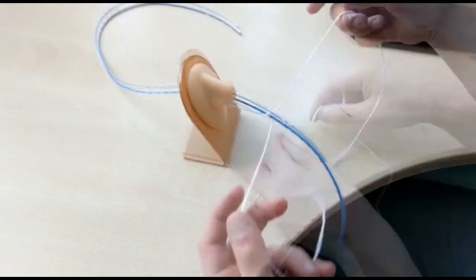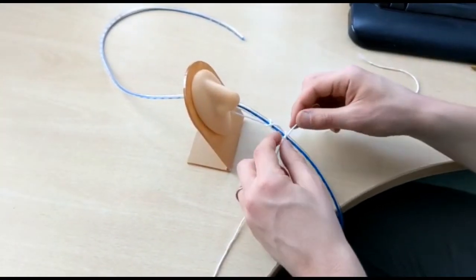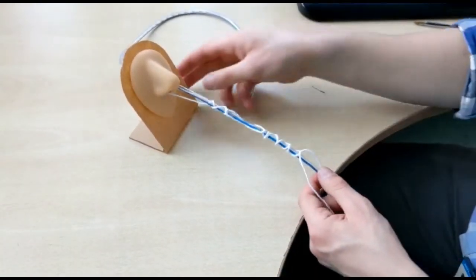Following the first knot, the string can be tied around the tube in a criss-crossing Roman sandal-like pattern. This should be tied very tightly and multiple knots are required to keep it secure.